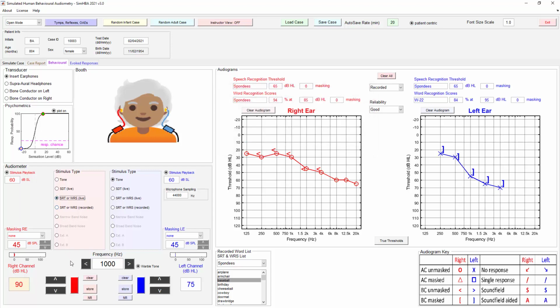Baseball. Baseball. And she responds baseball. We can also do this using pre-recorded lists. So these lists are down here to the right, where we can do spondees or NU-6 or other word lists. And you can also select your own word lists and call those in.